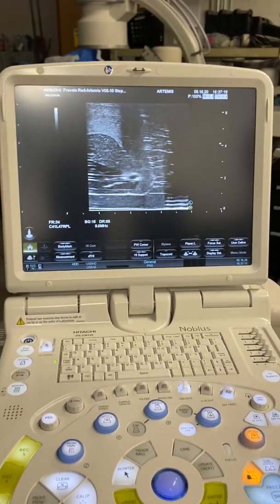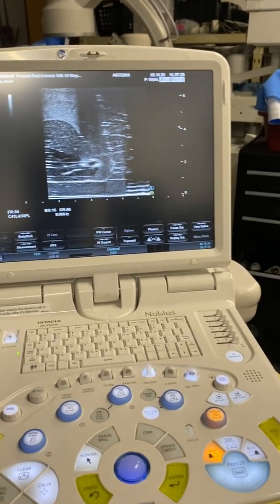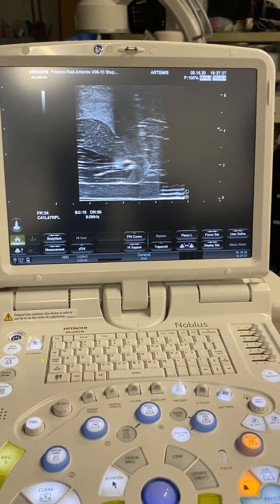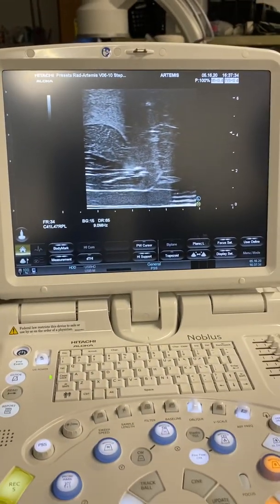After the fiducial markers are placed, we are going to do the SpaceOAR. Remember what I said before for fiducial markers - you want to compress the gland a little bit. You would have put the arm or the stepper up to compress the gland during the fiducial markers, that way the gland is held firmly in place.